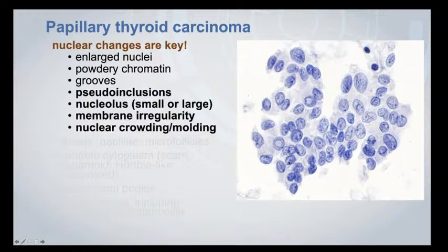Generally, you'd like it to be at least a third or a half the diameter of the nucleus, and it should be well circumscribed. It should be punched out because it is actually lined by a nuclear membrane. Finally, it should have the color and texture of the adjacent cytoplasm. If it's just a small white circle, it might be an artifact and therefore is not quite so reliable.